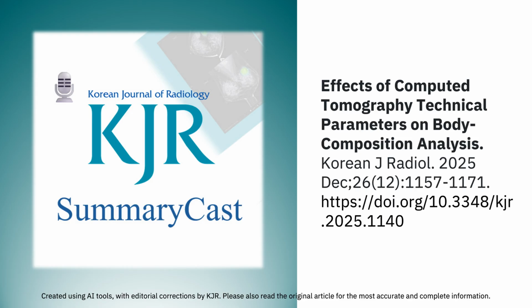What about fat on VNC? The VNC images showed significantly higher attenuation for both SAT and VAT compared to true non-contrast. But the area measurements were similar or had only minor differences. So the density is off, but the area might be acceptable. So VNC isn't a magic bullet. It introduces its own systematic bias. It seems so. And other studies report inconsistent results, which might be due to different scanner technologies or contrast protocols. The bottom line is that institutions probably need to validate VNC for BCA in their own environment before using it as a replacement for TNC.